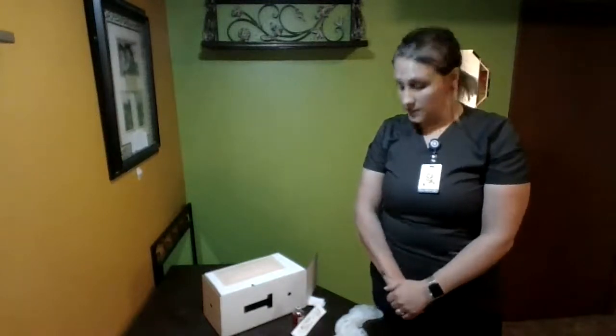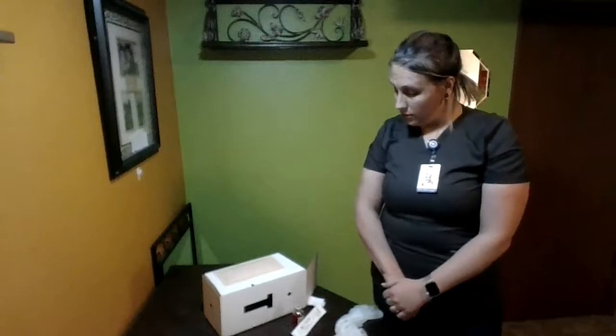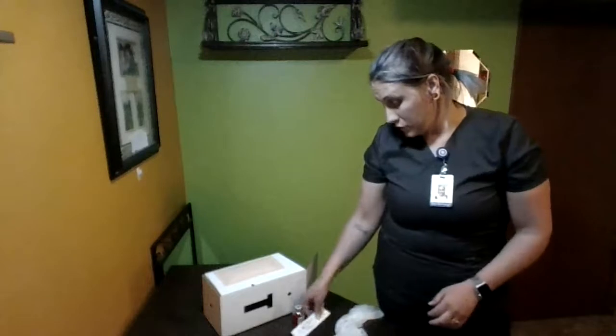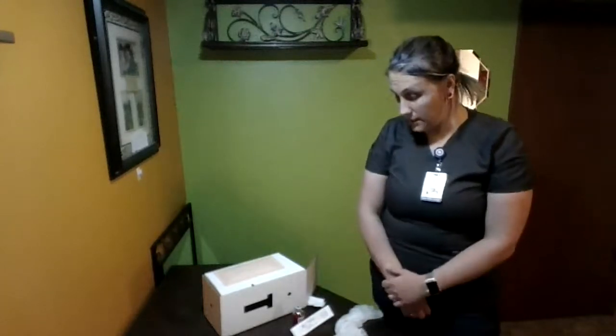Today I will be demonstrating how to do an intradermal injection. So the first thing I did is gathered all of my supplies. I have gloves, a gauze pad, an alcohol pad, my tuberculin PPD solution, and a needle that's a 25 gauge by 5/8 of an inch.